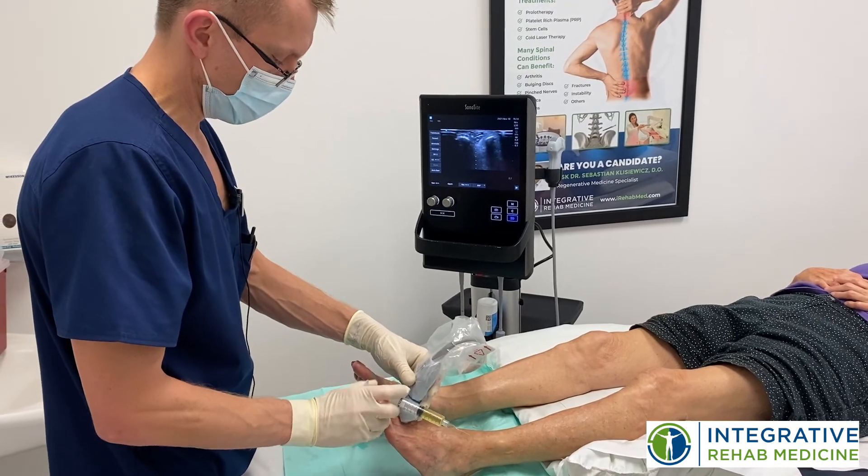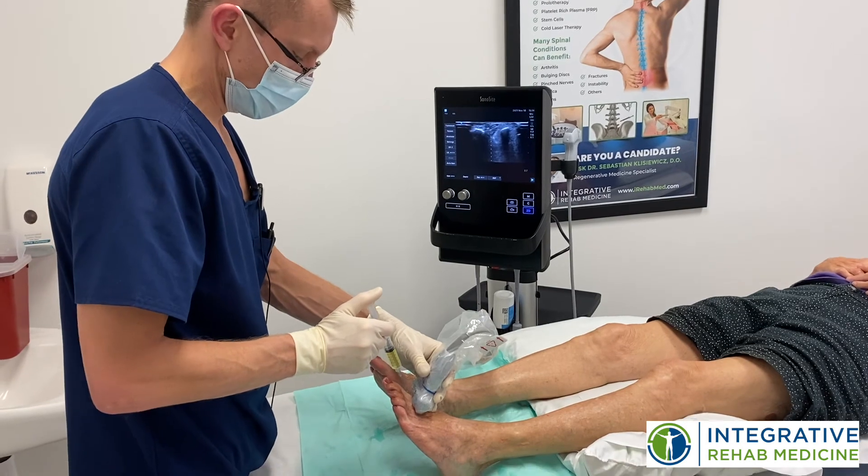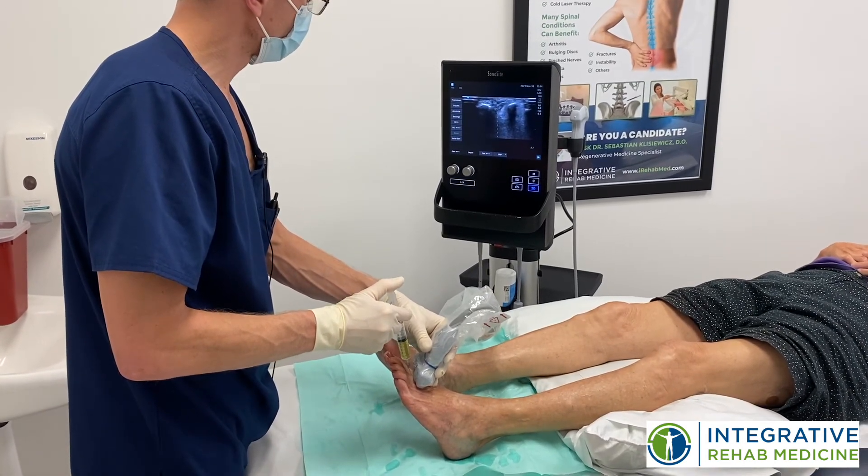We're at the end of the procedure, and we're just going to treat the nerves between her toes. That's going to give her some improved sensation and movement of those toes.